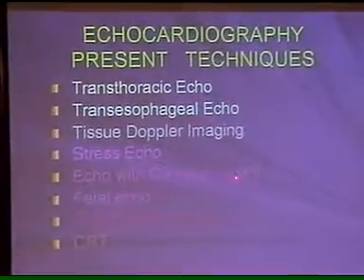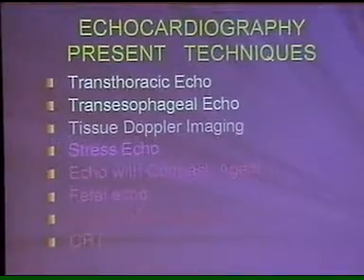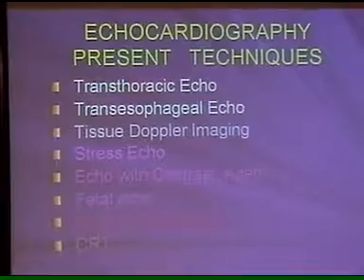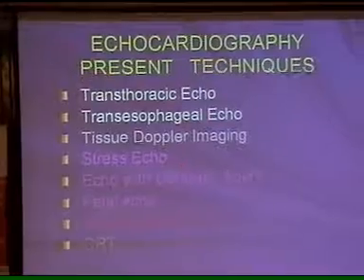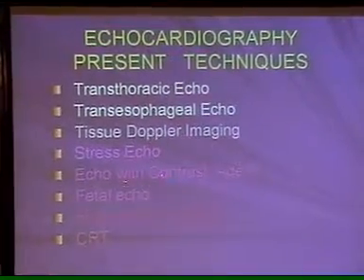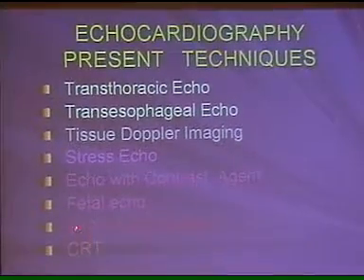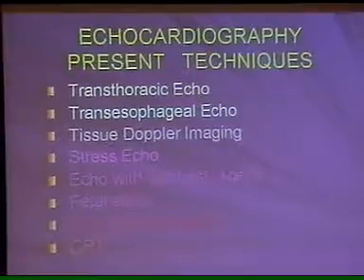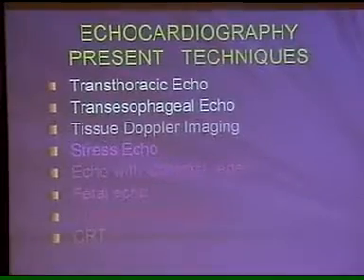There are different modalities of echo: transthoracic echo, transesophageal, tissue Doppler imaging, stress echo, echo with contrast agent, fetal echo, strain rate imaging, and something new, cardiac resynchronization, the role of echo in cardiac resynchronization therapy. Alhamdulillah, we are doing all these modalities in PIC, excluding these last two, which I have just started in PIC, and I'm already working on a project in the private sector with Doctors Hospital and Aga Khan.